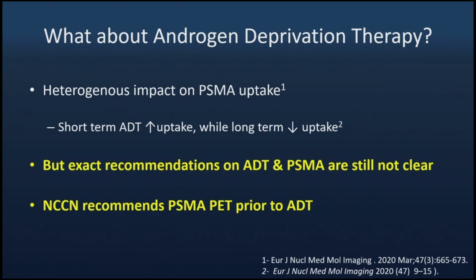Has anybody looked at it as an adjunct, like increase the sensitivity, give them ADT later than scan? Awesome question. The question is whether we'd use ADT to try and increase the sensitivity of the PET scan to initiate therapy. I'm not aware. Have any of you seen it? Yeah, so actually Tom, you did. Tom has a paper.